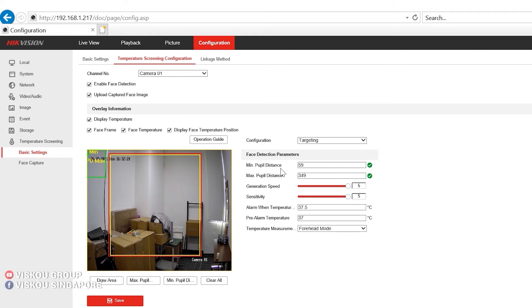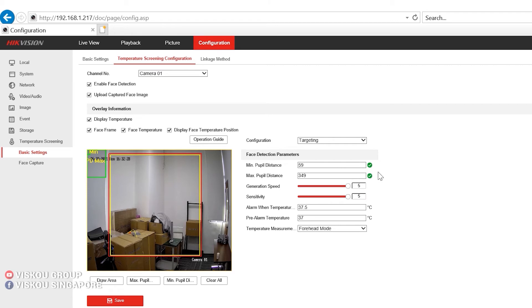You also can set the minimum and maximum pupil distance. This is the recommended pupil distance that we recommend you to set. And here you also can set the speed and sensitivity.